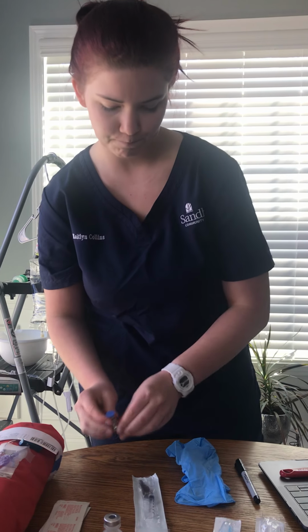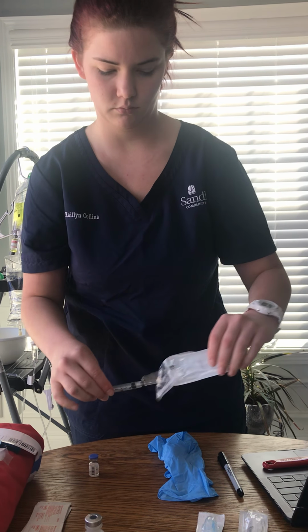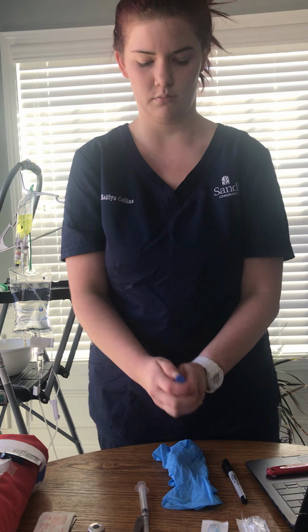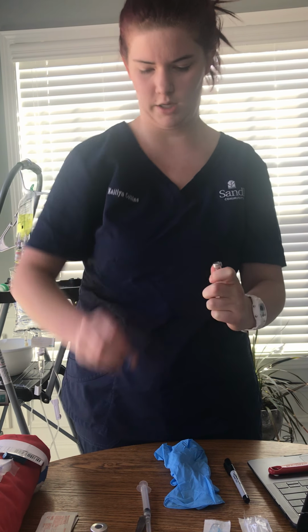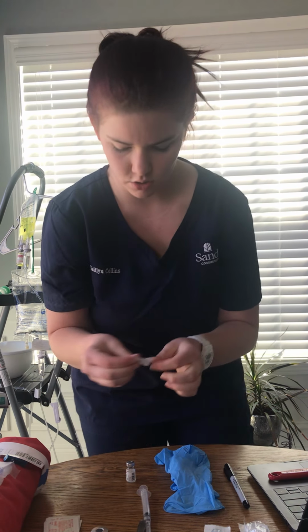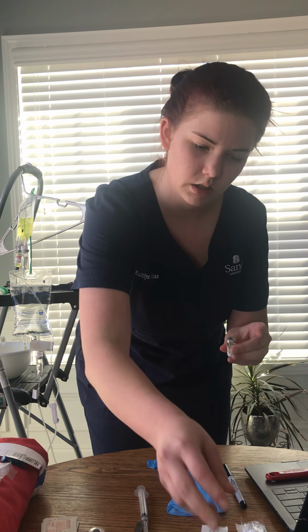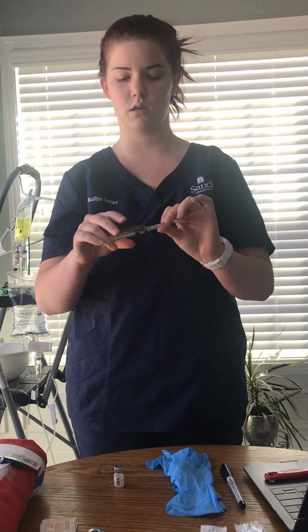Okay, just make sure I have everything. All right, I'm washing my hands, and I'm going to get these medications prepared. Trash. All right, I'm going to pop this top and hopefully not throw it. Okay. Trash and scrub for 30 seconds. And let that dry. And using the OK method here.